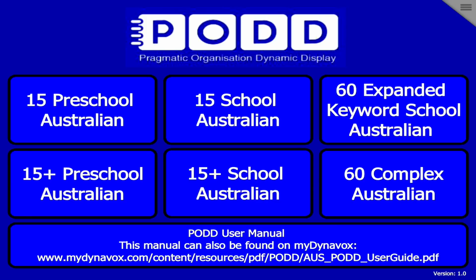pod communication book. So you can kind of see that they cover the continuum of those individuals who might already be using a low-tech communication book using the direct access templates that you can create those with. So we're going to have a little look. We might just start with the 15 plus school.